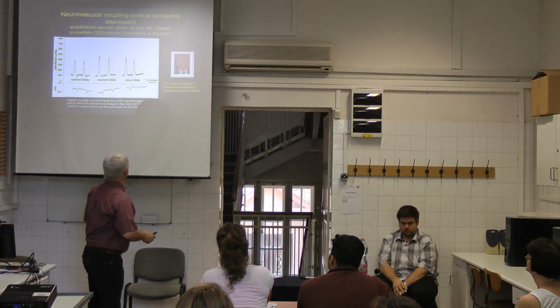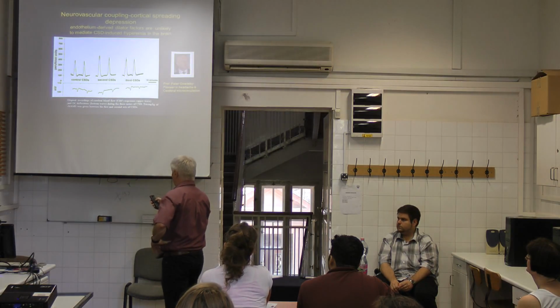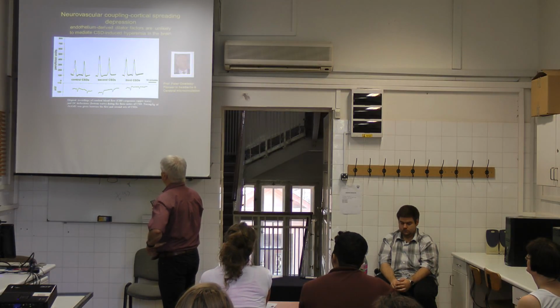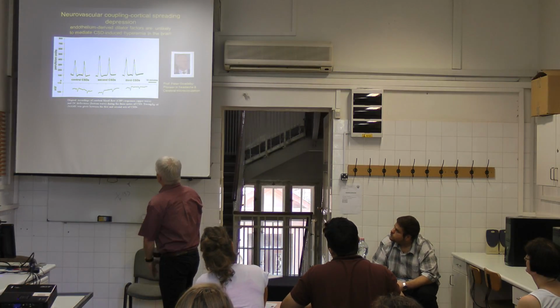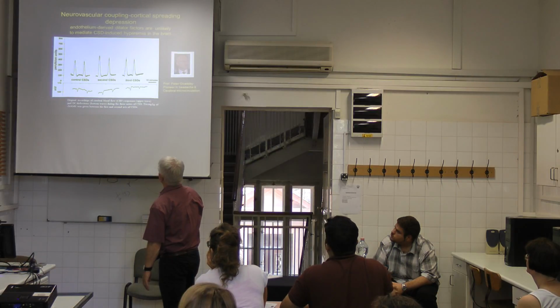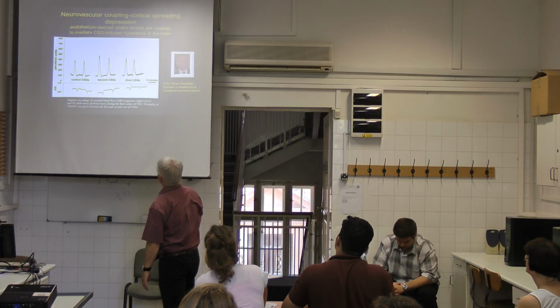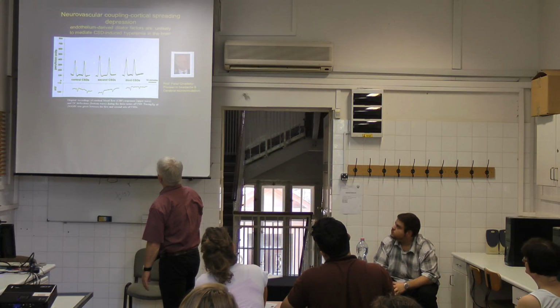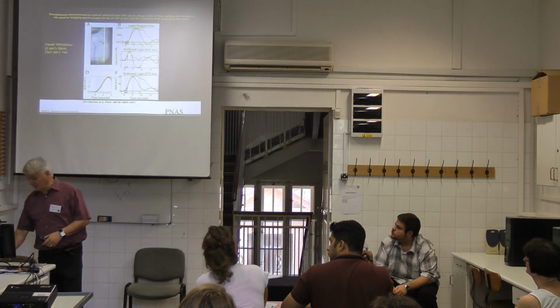This is also an example of how the local blood flow can be monitored by laser Doppler flowmetry. These are control circumstances. We did something. I wanted to show you that in a certain small region, the blood flow can change a lot during this type of stimulation.